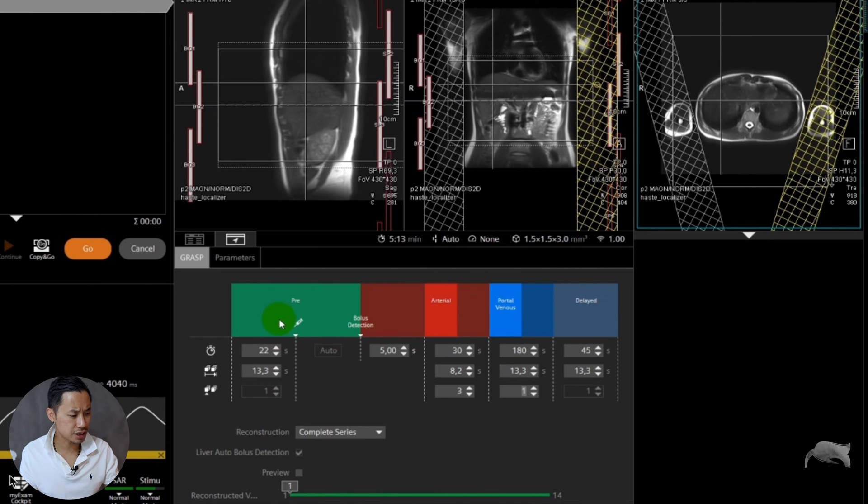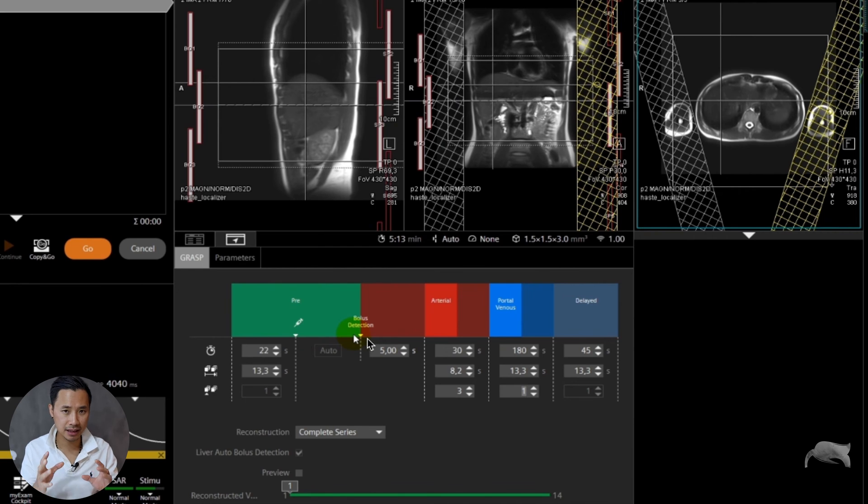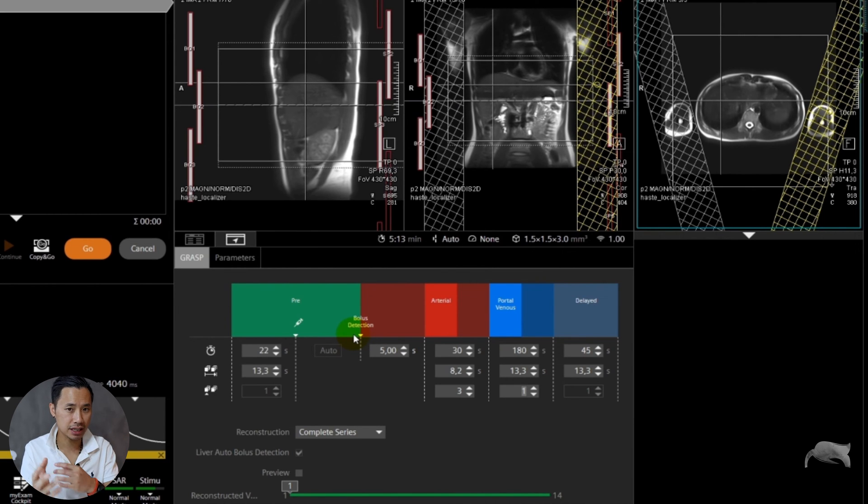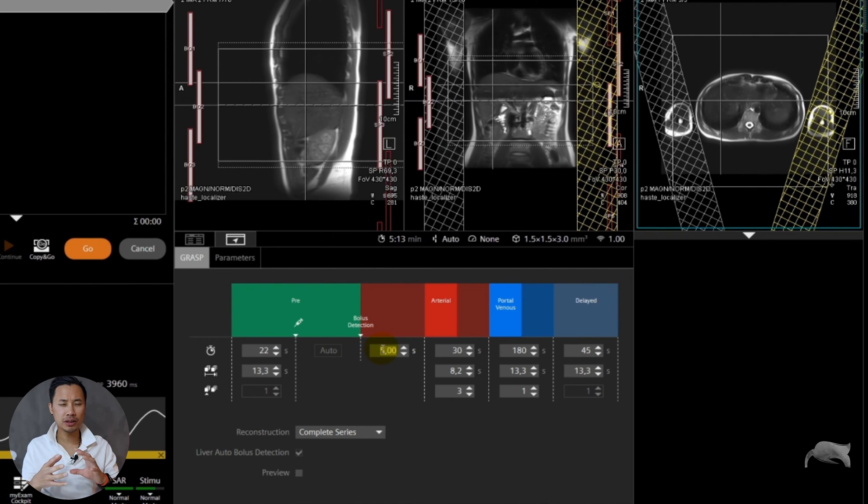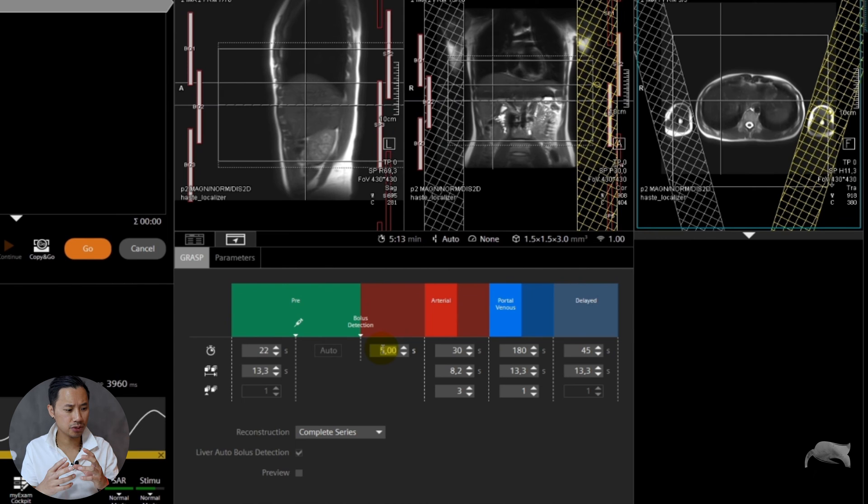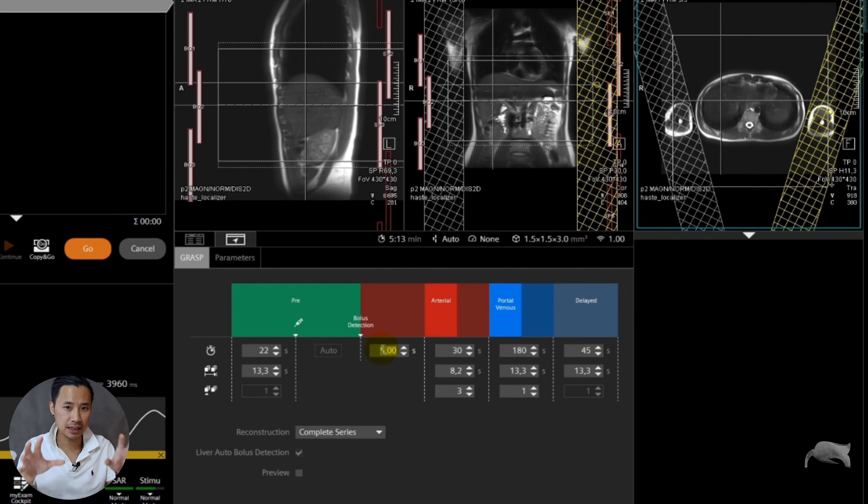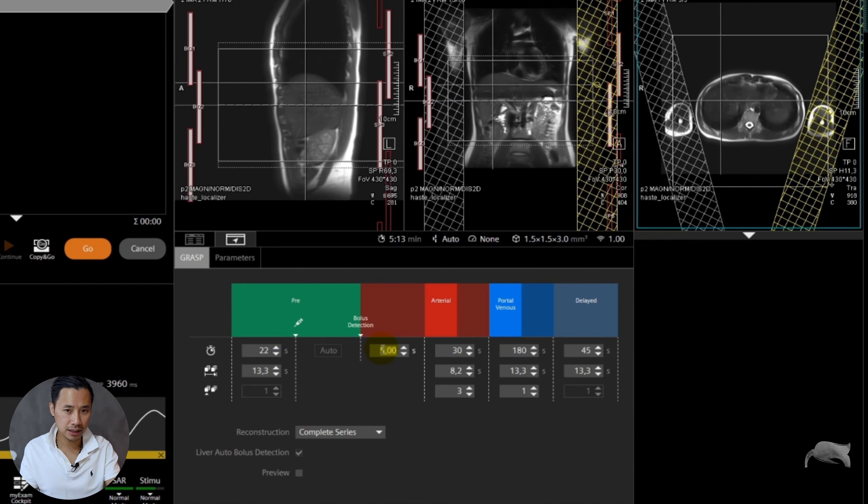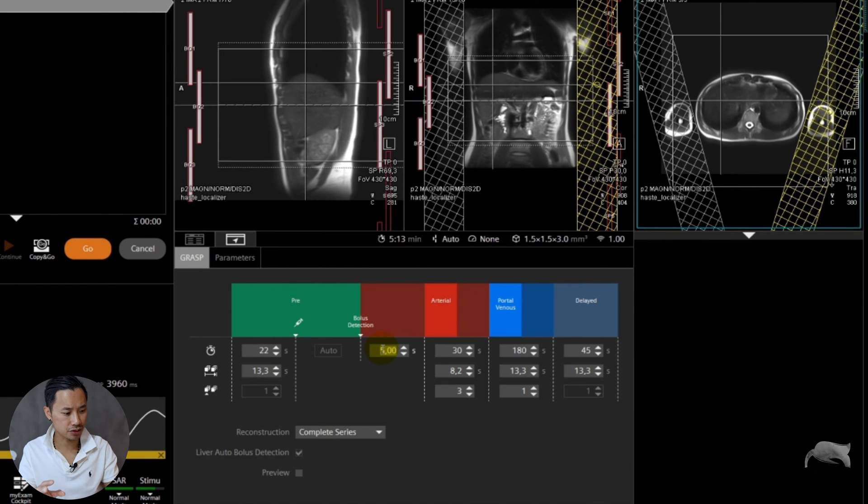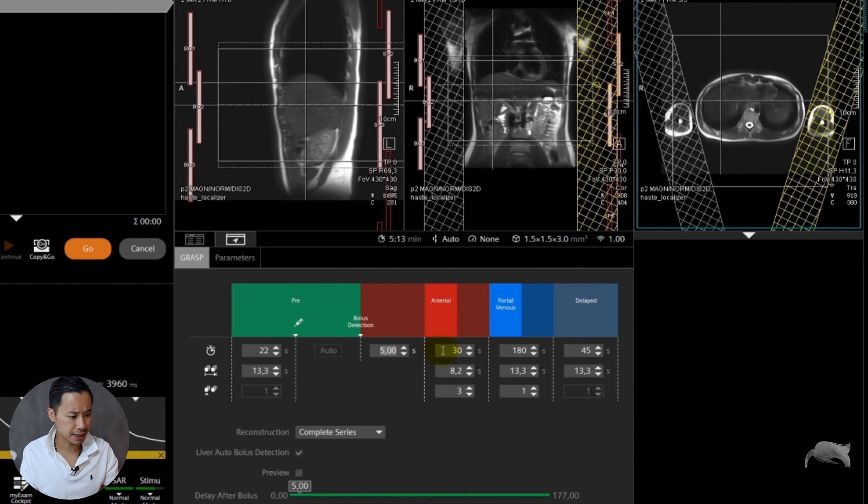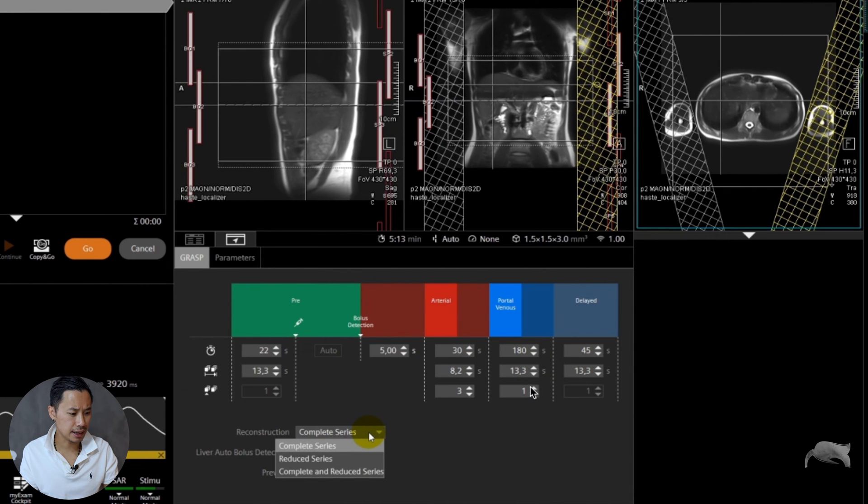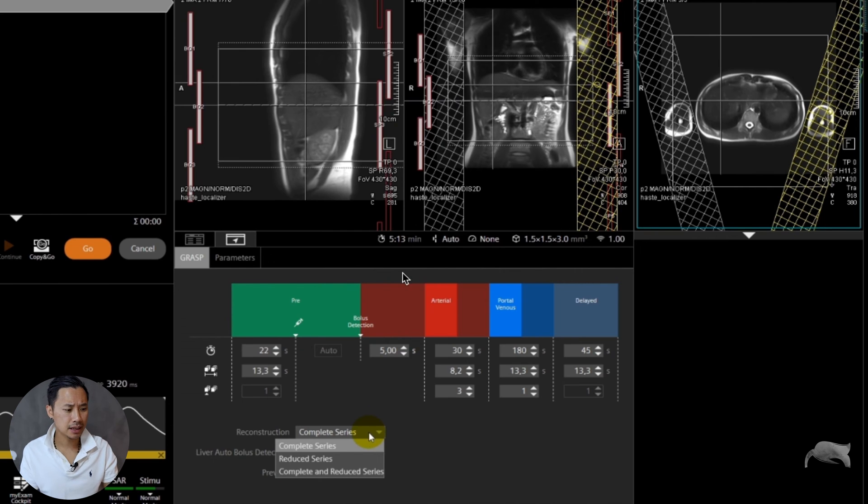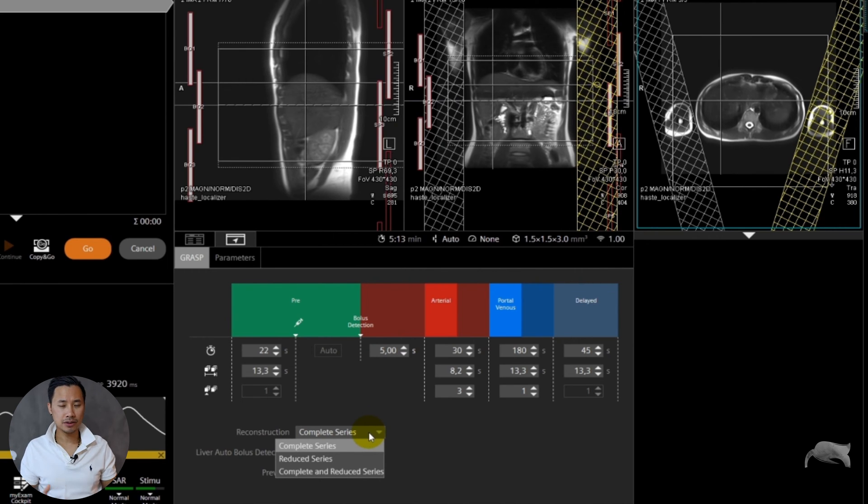So you inject the contrast. While the contrast is inside the blood, it will automatically detect the contrast. You can control how many seconds you want to add. Here is five seconds. Why? Because you don't want the early phases, you want to image the liver. From the detection to the liver it takes around five seconds or so. That's why you put the five seconds there, and then you go arterial, portovenous and delayed.